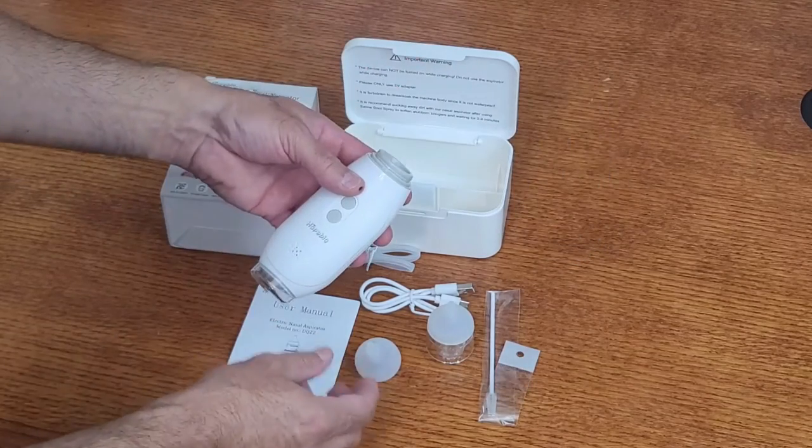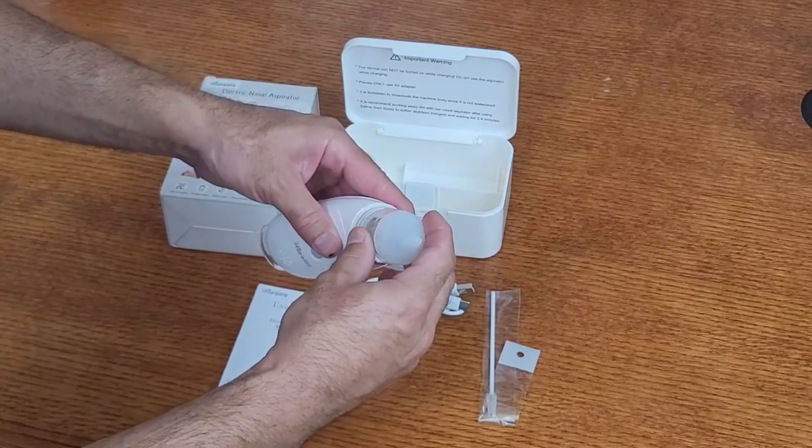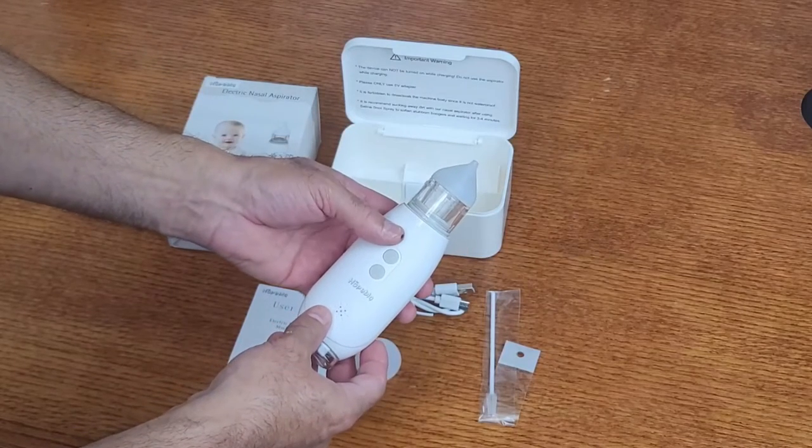How the device works is you grab your preferred suction tip, connect it right here to the suction device, and then give it a little quarter to half turn and the suction tip will lock into place.